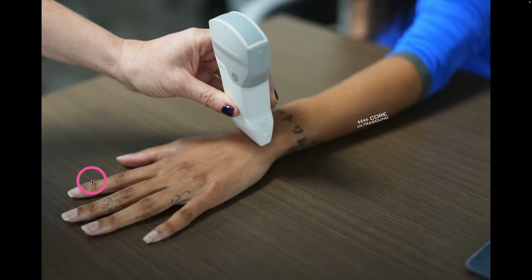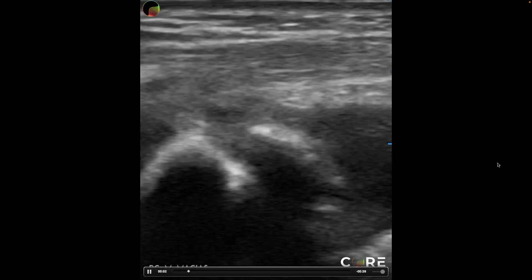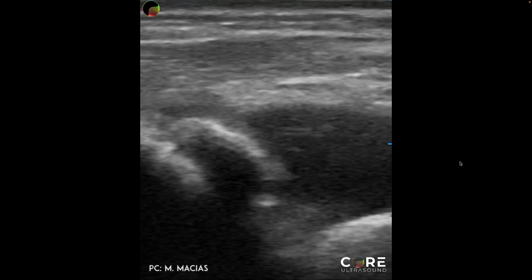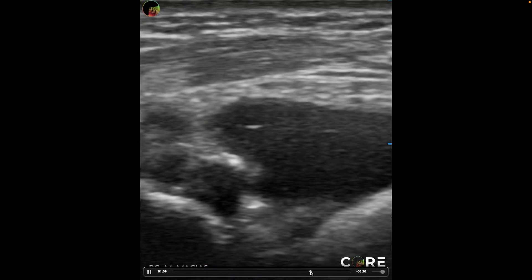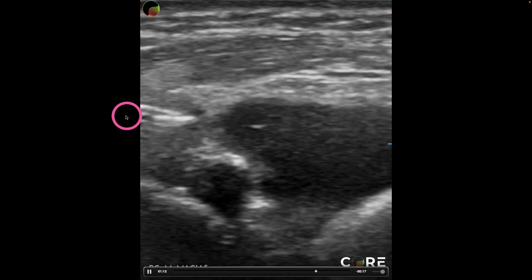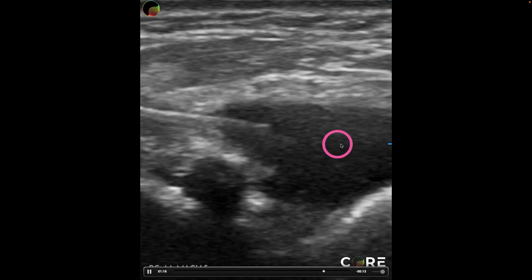If you want to do the out-of-plane or the way out-of-plane, the probe is going to go transverse to the arm, and you're going to go straight down either here or on the other side of that transducer. For an in-plane approach, you're going to come in from a lateral to medial orientation. Here's an example of an in-plane approach to aspirating fluid from that wrist joint, and here we can see that needle coming in to aspirate.